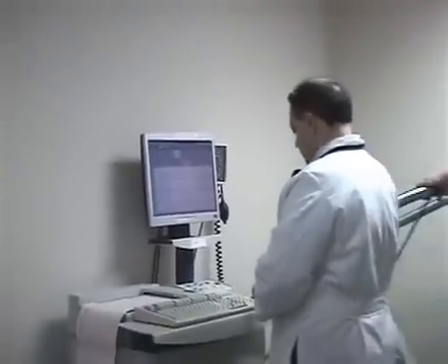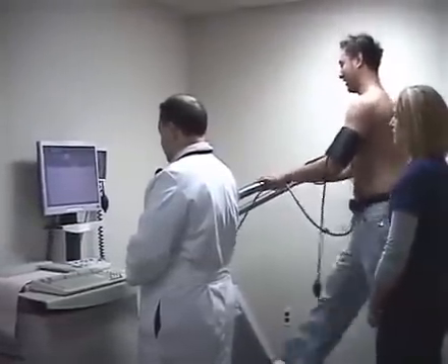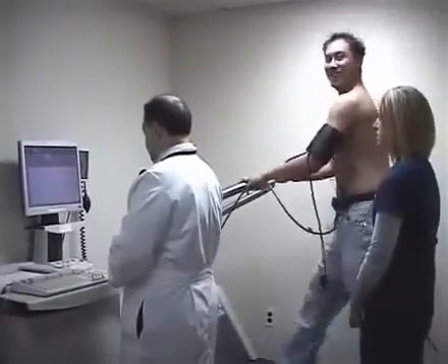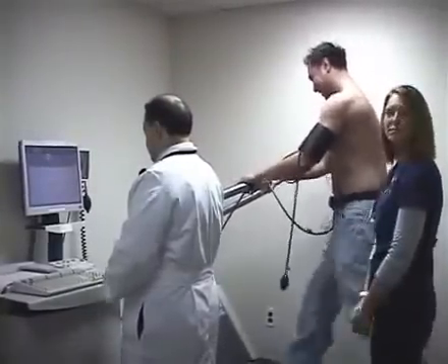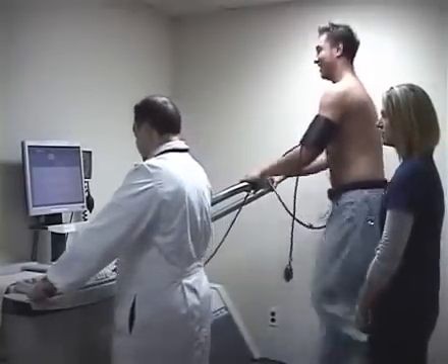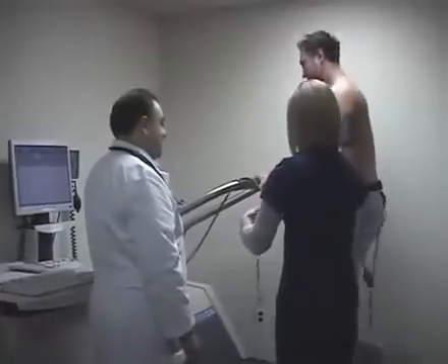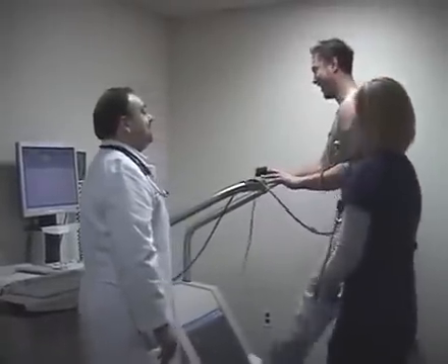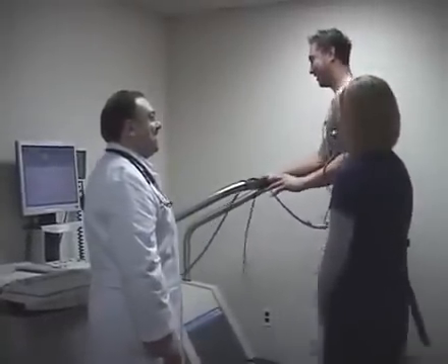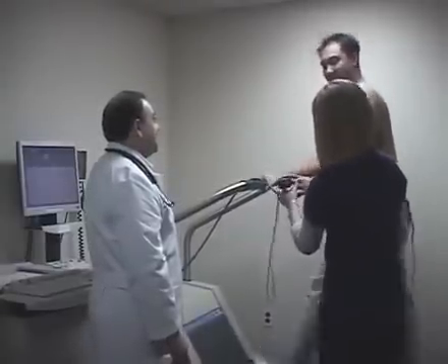This patient on the treadmill is about 27 years old and his target heart rate is about 150. As soon as he reaches the target heart rate, we stop the treadmill and bring him to the table. We then look at his heart with the ultrasound machine to make sure there is no significant blockage in the arteries and that the walls and valves of the heart are moving well.